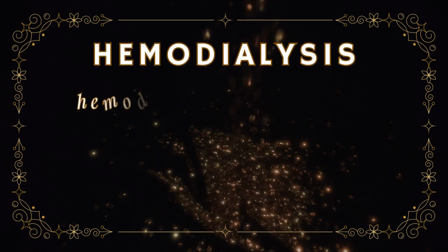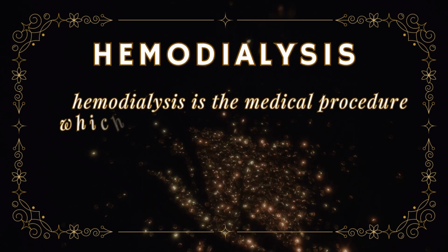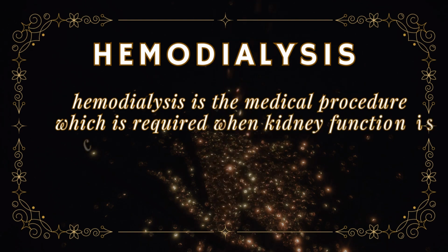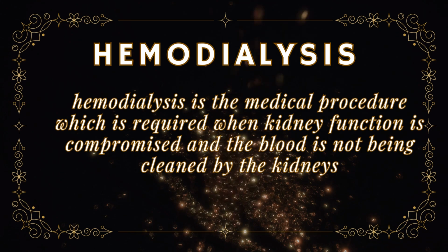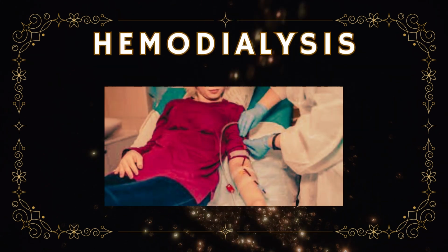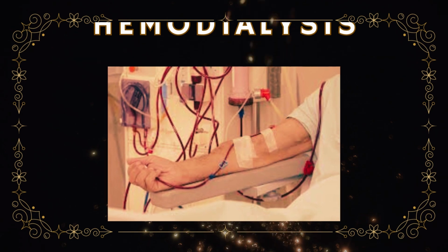So to summarize, hemodialysis is the medical procedure which is required when kidney function is compromised and the blood is not being cleaned by the kidneys. To remove all the toxins and excess fluid, the procedure of hemodialysis is carried out.